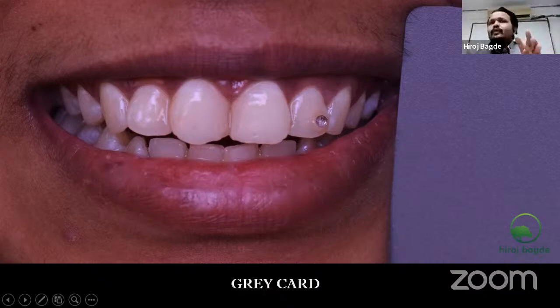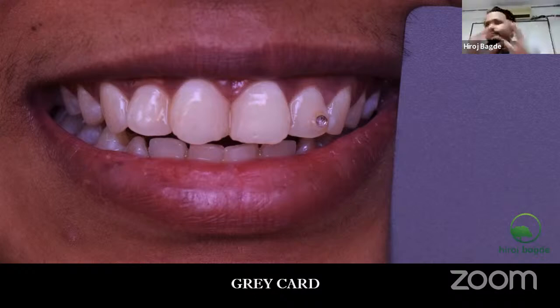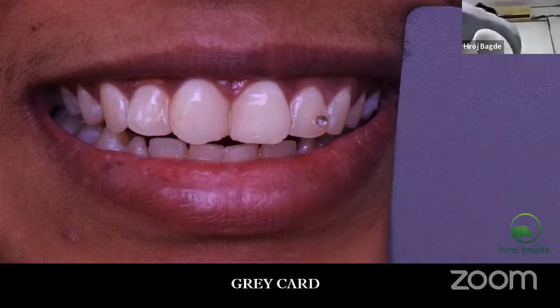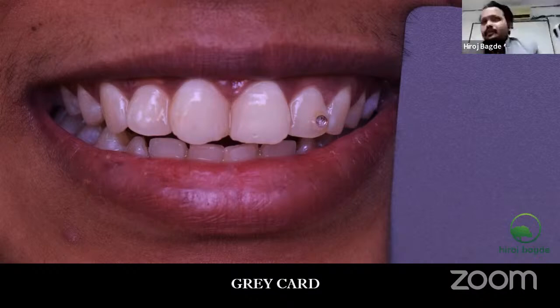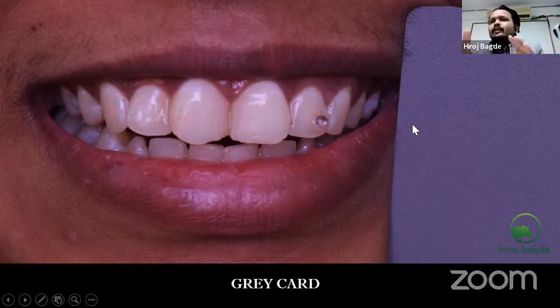What does this gray card do? Since ages, nothing is truly white. If I say this is white, and this is also white, I am telling you that gray is the new white. It was declared that gray is the new white for photographs only, not for other things. Now, a gray card is a particular card where the color is supposed to be neutral.